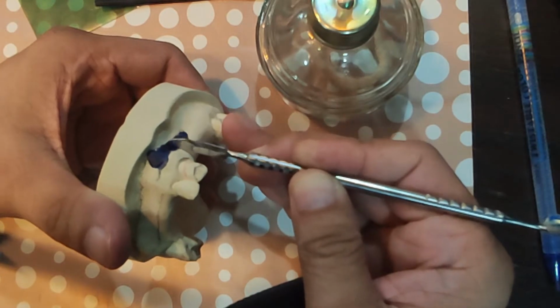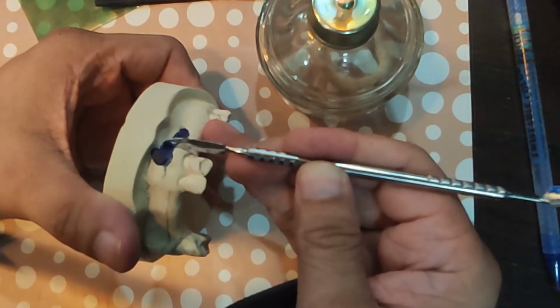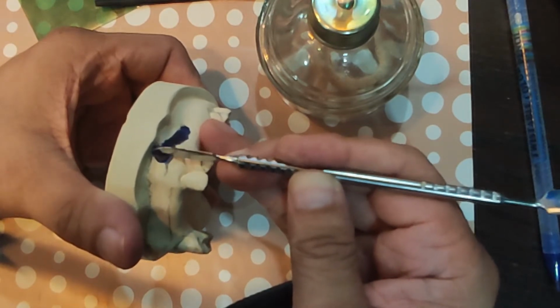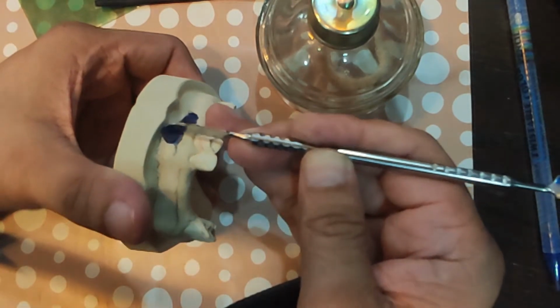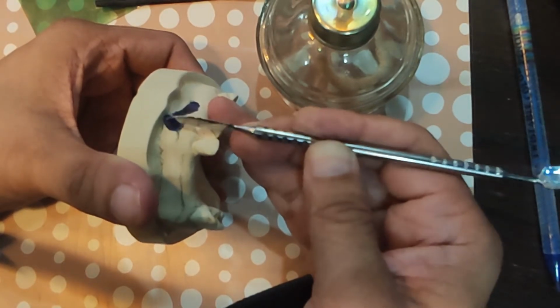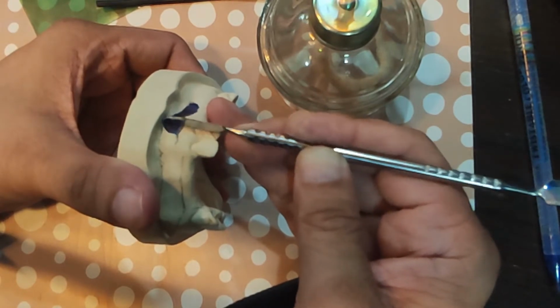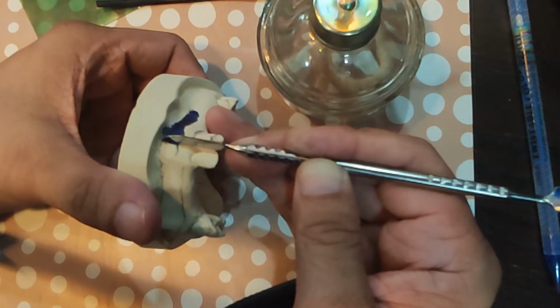Notice that when I'm carving, ganito yung orientation ng blade, it needs to be parallel to where your supposed path of insertion is, right? So you keep doing this until your tissue undercut is blocked out.